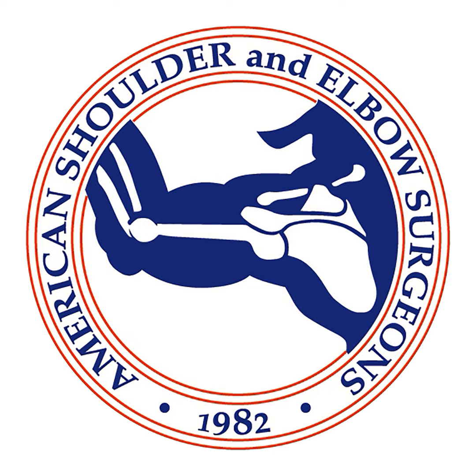The one thing that the listeners can take away, and this wasn't the case maybe 15 or 20 years ago, is that I think the patches now are safe. It doesn't seem like we're seeing catastrophic issues from the insertion or the devices which are used to put them in. It doesn't seem to compromise future surgeries. We're not seeing inflammatory or immune responses to them that are detrimental to the patient. So, the safety aspect, I think, has really been worked out.